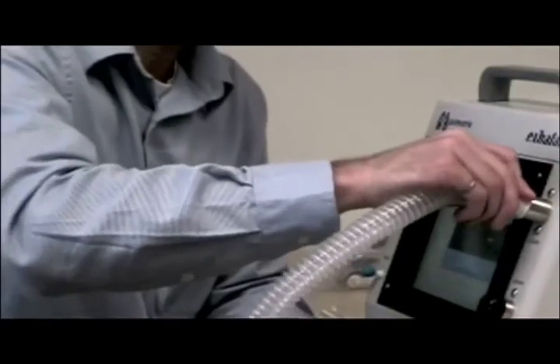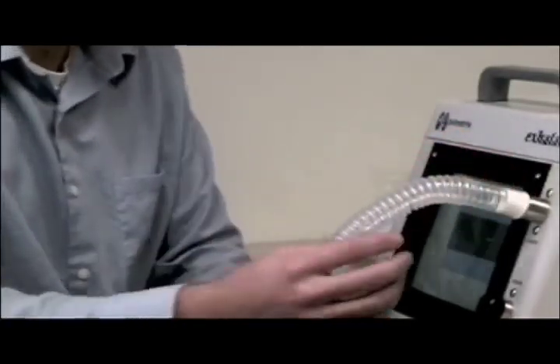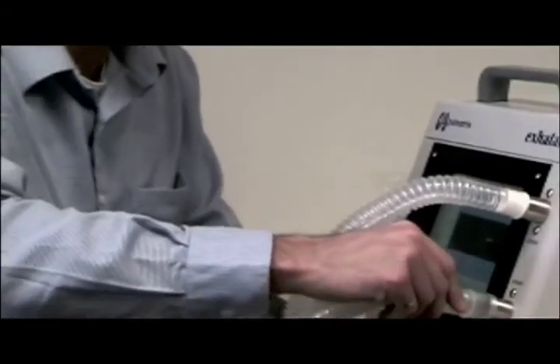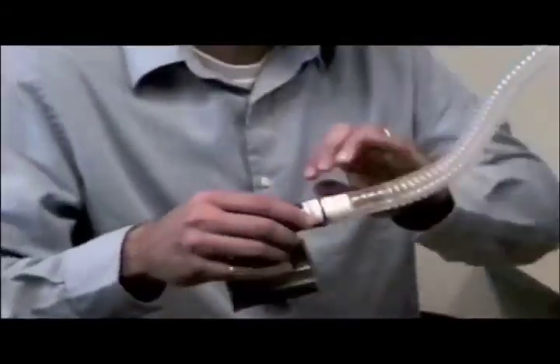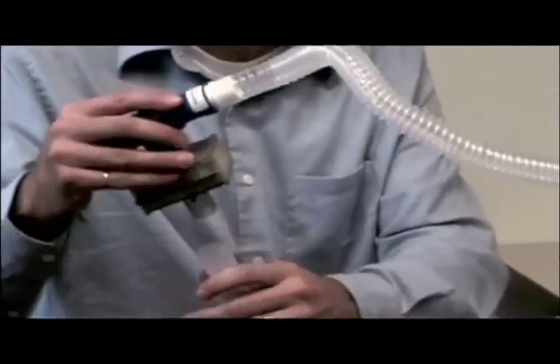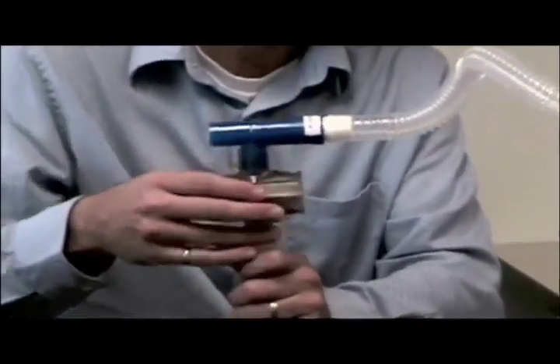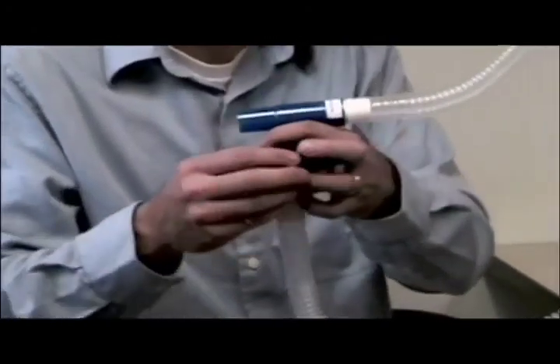Two sets of flexible tubing are used to connect the system to the user — one for the air they breathe in, and the other for the air they breathe out. Each person gets their own kit to breathe through. For your safety, it contains a filter and one-way valve to prevent inhaling any particles that prior users may have exhaled.